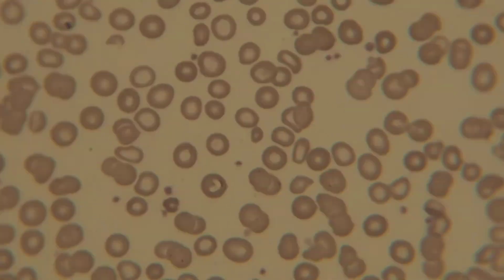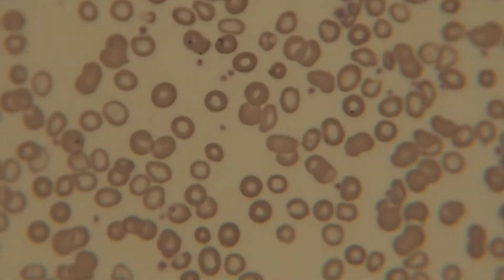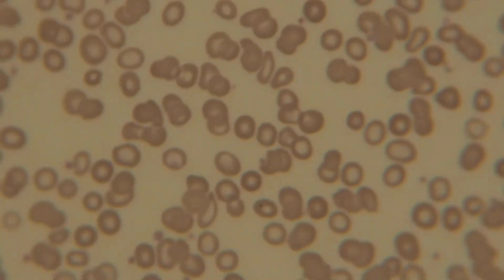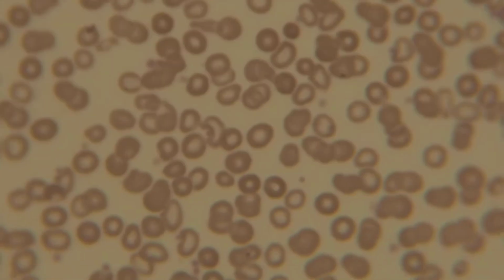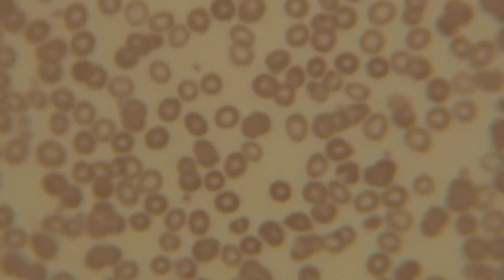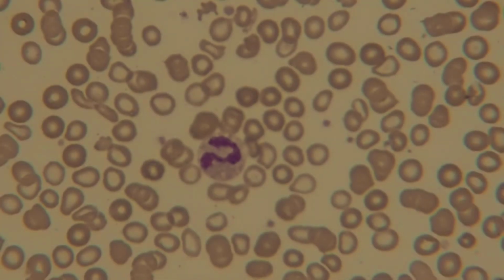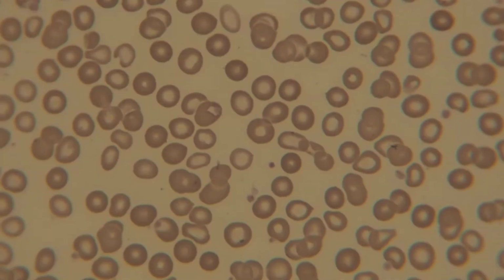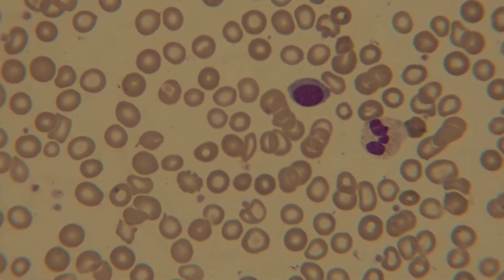Neutrophil. Neutrophil. Neutrophil. Neutrophil. Lymphocyte. Neutrophil.